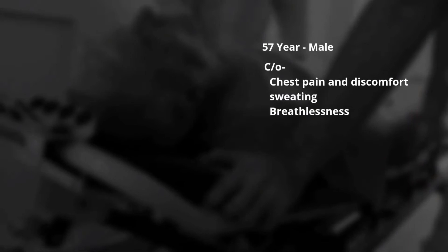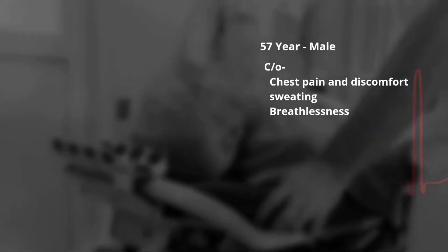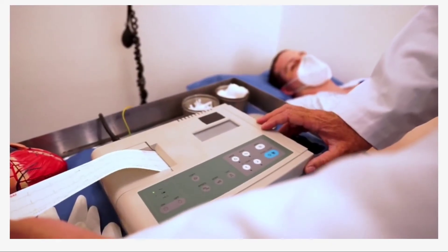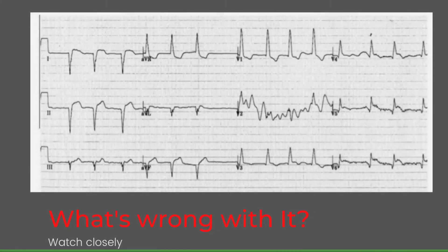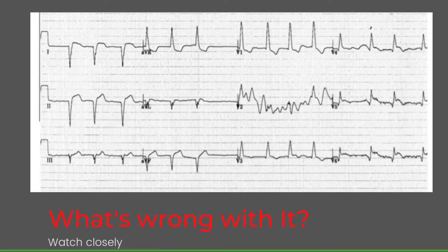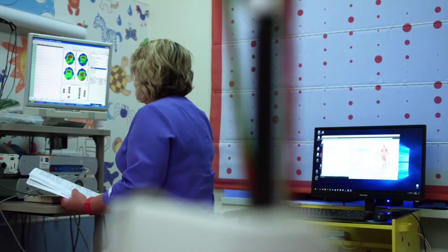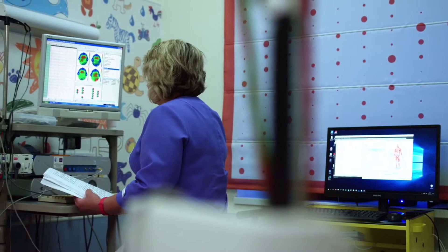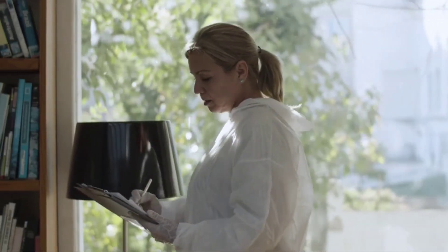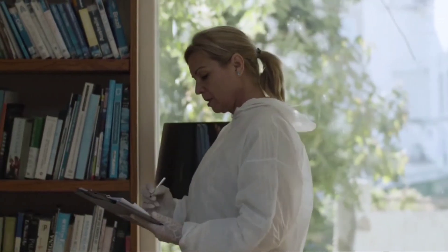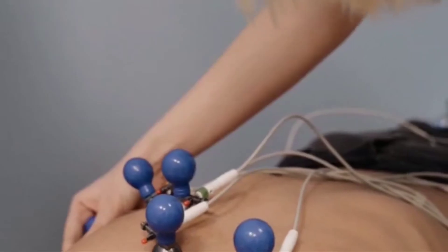A 57-year-old male walked into the ER with complaints of chest discomfort and sweating. An immediate electrocardiograph was recorded. Looking at this ECG — what's wrong with it? At first, the ER doctor analyzed it and prepared for thrombolytic therapy, but then the cardiologist, who has expertise in ECG interpretation, figured out that something was off.